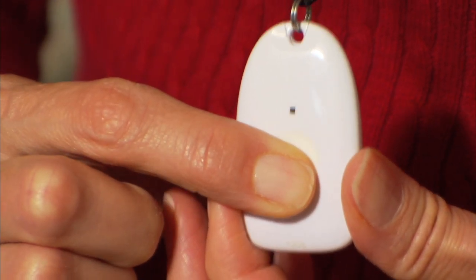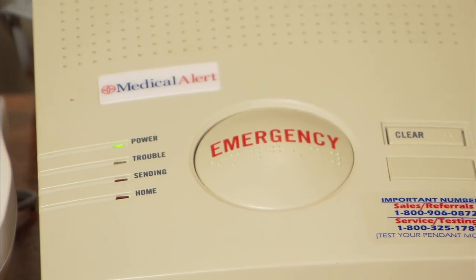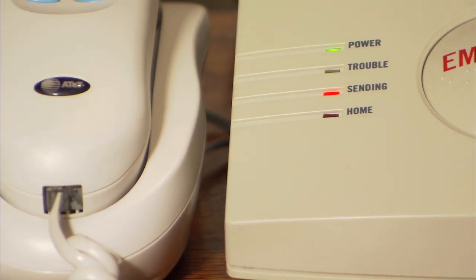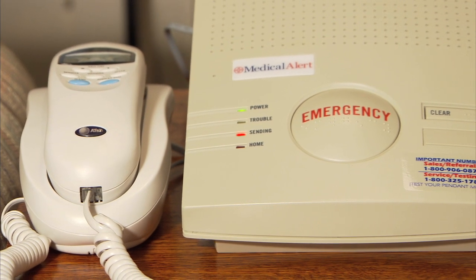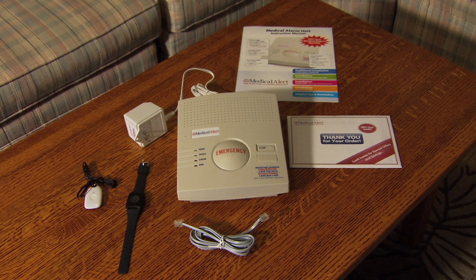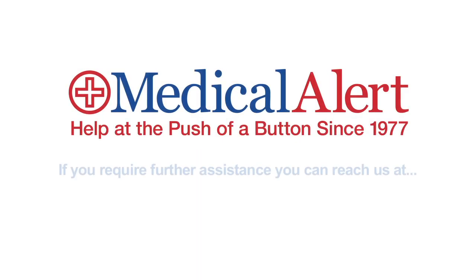In the event of an actual emergency, you can press the emergency button on your pendant or wristband, or the large circular button on the base unit labeled emergency. The base unit will acknowledge the emergency activation by repeating emergency, and then emergency reported, just like it did during your test call. An emergency operator will answer over the speaker to provide assistance. Congratulations! You have now successfully installed and tested your medical alert system. It is now online and ready to use to provide you with help at the push of a button in any emergency. Thank you for choosing Medical Alert.